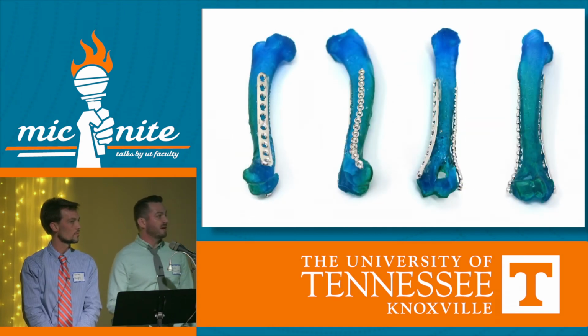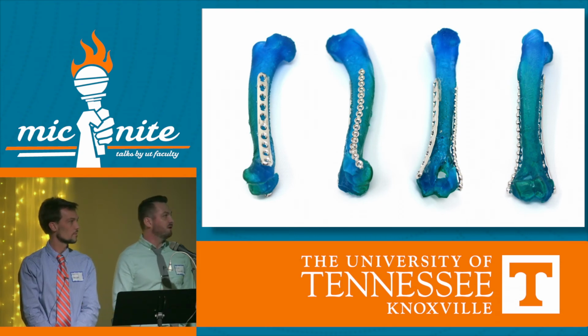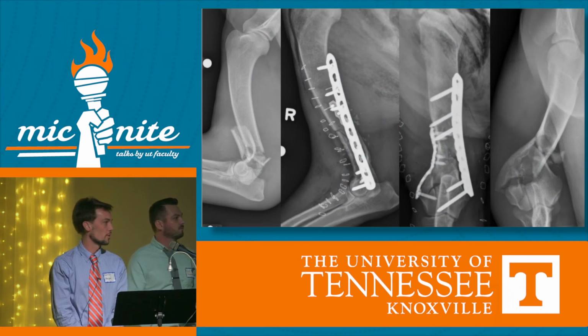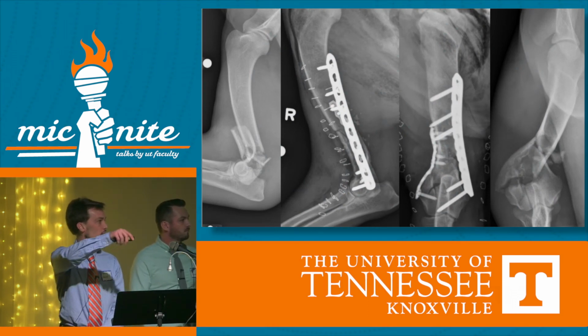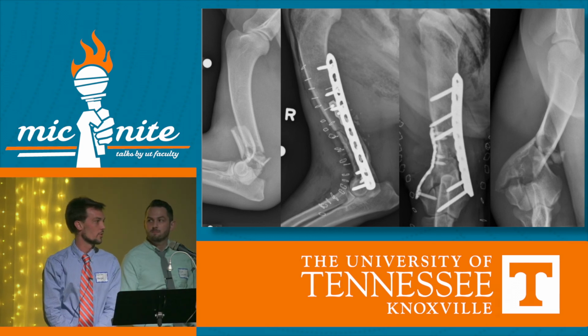We can actually print that same bone, and what we get is all these implants, these stainless steel implants that you see here, they come to us straight. And so when we get into surgery, we often have to bend them and torse them to fit on the bone. But now we can do some of that work before we actually get into the OR. So after each orthopedic surgery, we always take radiographs to make sure that everything is as well as we want it to be. So you can see that the fracture on that view is much more aligned. You have a large plate, a smaller plate, and everything is held in place by multiple screws. So it's a very good outcome for the dog.